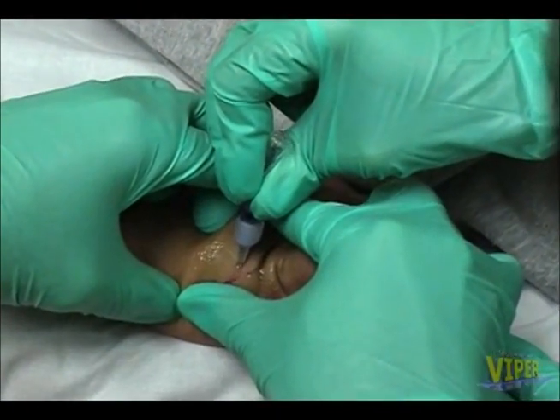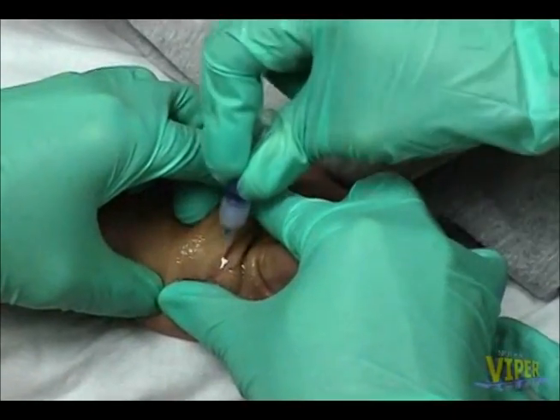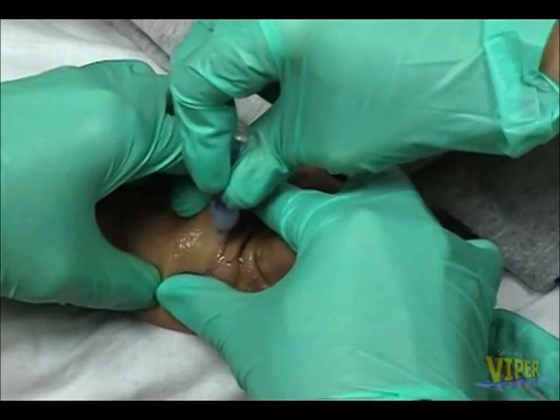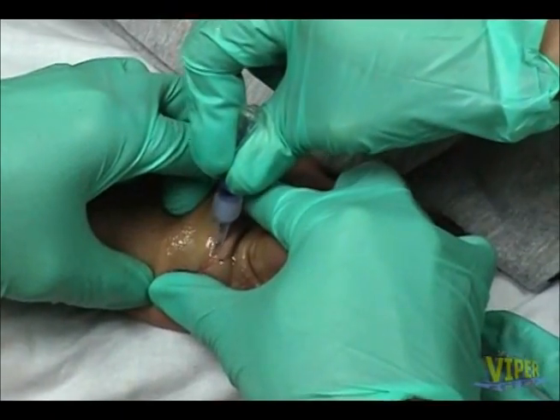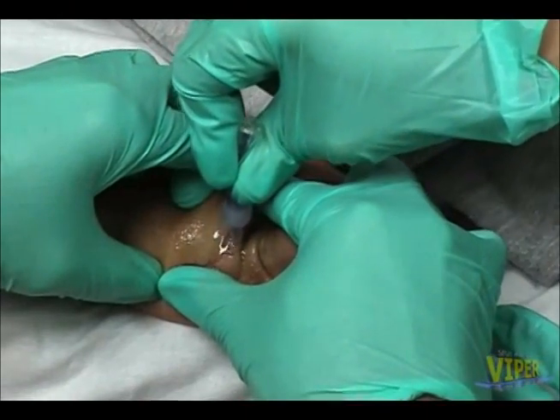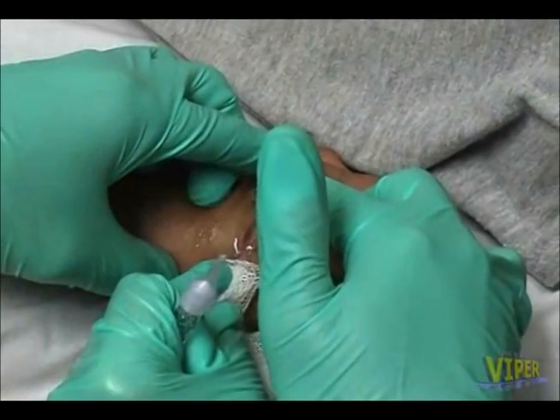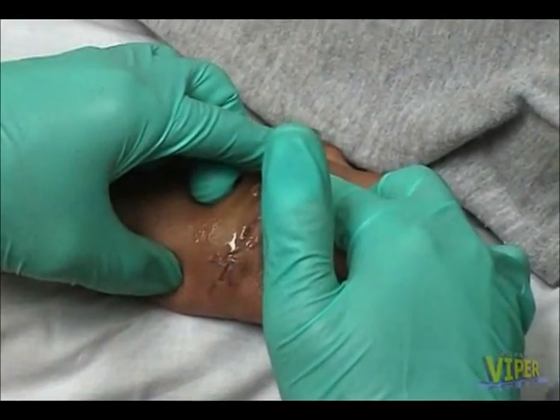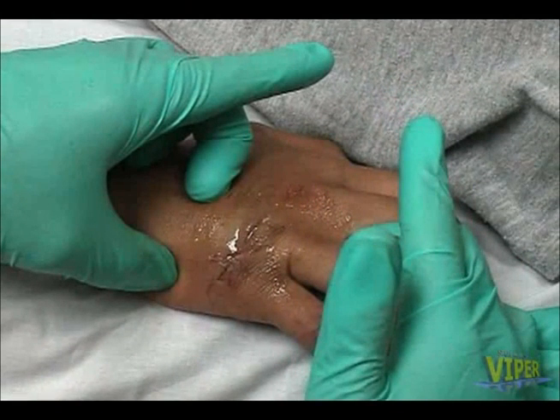Crack and squeeze the tissue adhesive vial until the solution reaches the applicator tip. Apply the tissue adhesive in three layers, separated by 20 to 30 seconds of time. Each layer first paints over the laceration and then circumferentially covers a wider and wider surface area.